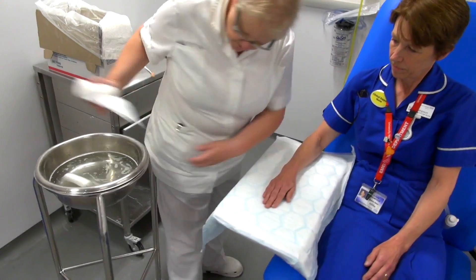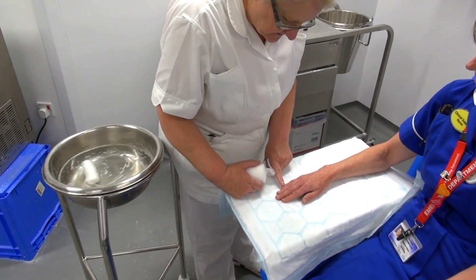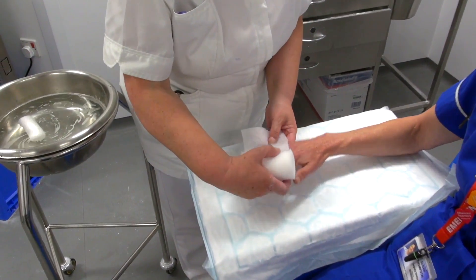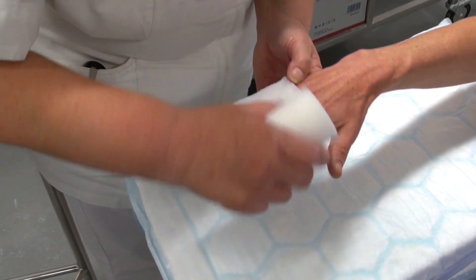So, as normal, you put your bandage on. Because we're going up to the tip of the finger, you put your padding on just above your finger.